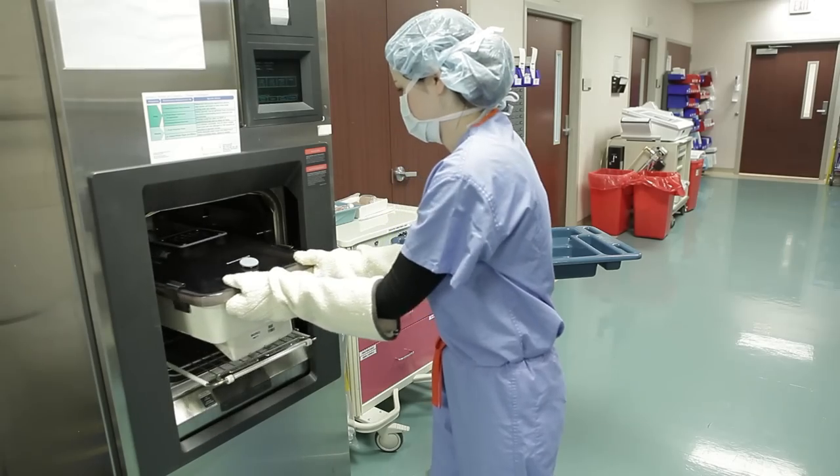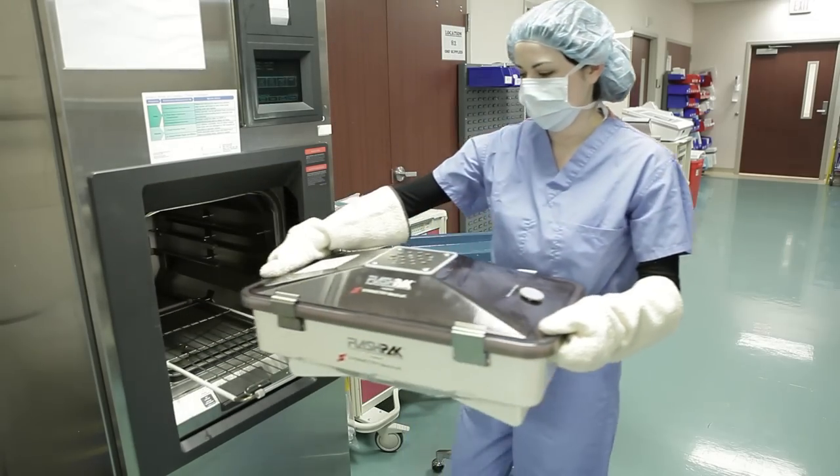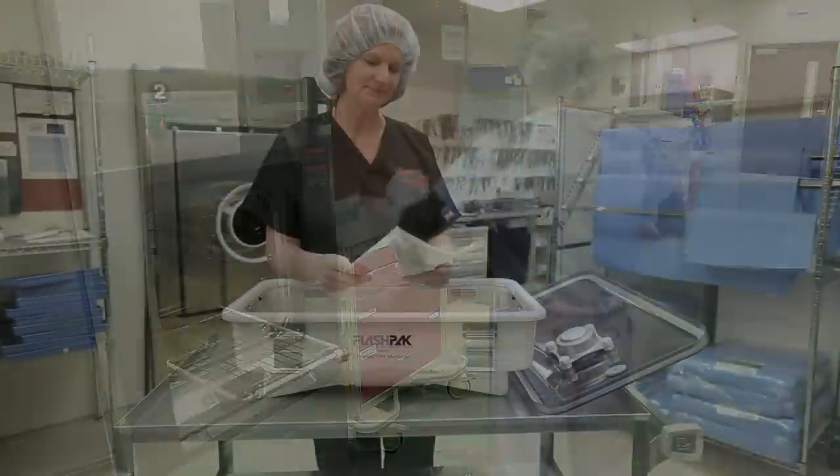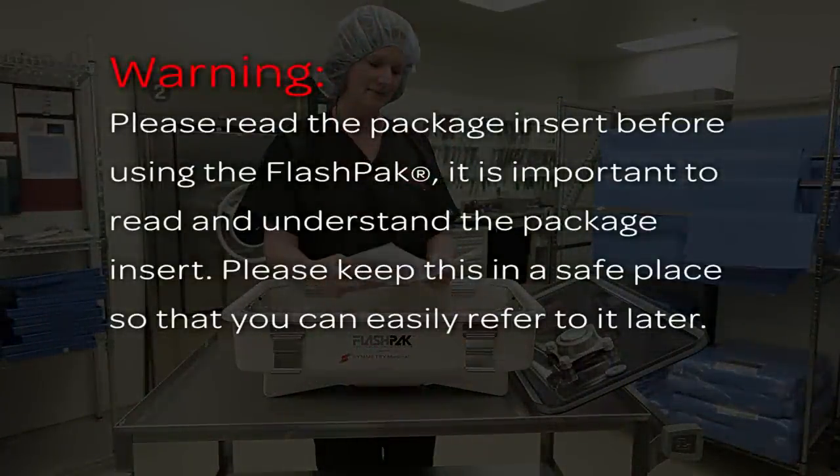Its closed system design prevents recontamination of sterilized devices during transportation to the location where they will be used. Please read the package insert before using the FlashPak. It is important to read and understand the package insert. Please keep this in a safe place so that you can easily refer to it later.